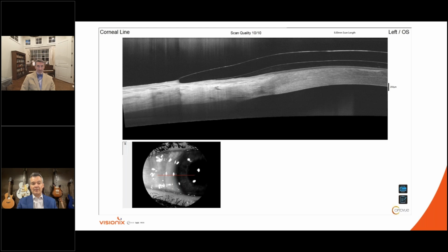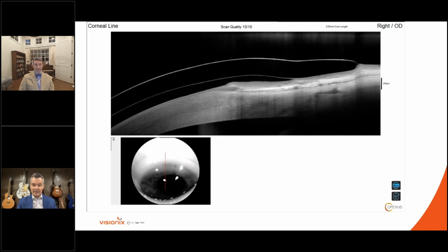This is another example of a situation where the most distal portion of the landing zone is just a little bit of what we would refer to as toe down, and the heel is just a little bit up. We really want that consistent landing zone along the whole profile of the landing zone on a scleral lens when we're fitting it. So the way we would communicate that to the lab is, whatever meridian we're looking at, we just want to bring the toe up subtly in that patient. And this is what we're looking at when we're looking at more of an aligned fit. You can see that the trajectory of the landing zone very evenly distributes its weight all across the foot of that landing zone, with plenty of room for limbal clearance.